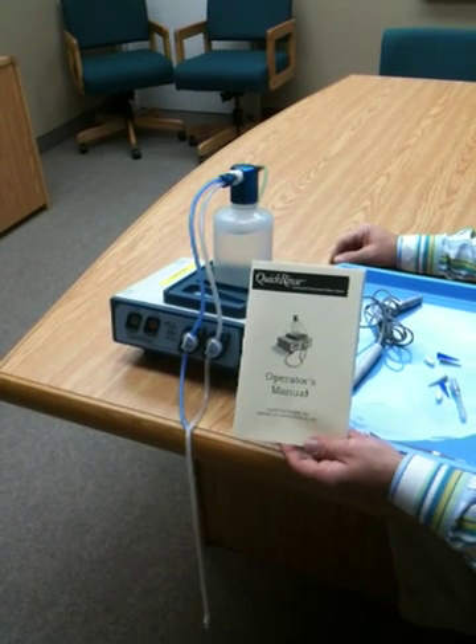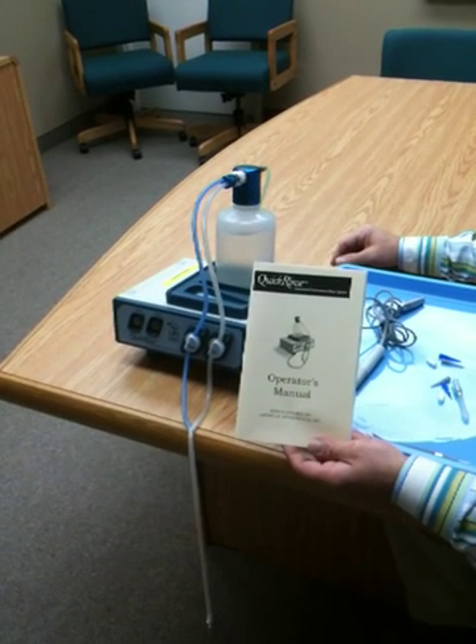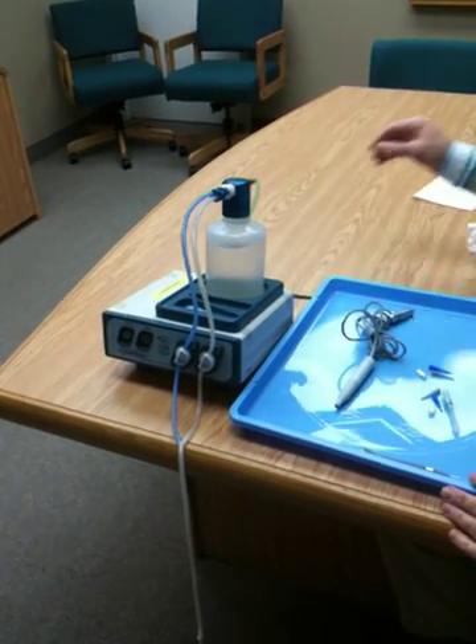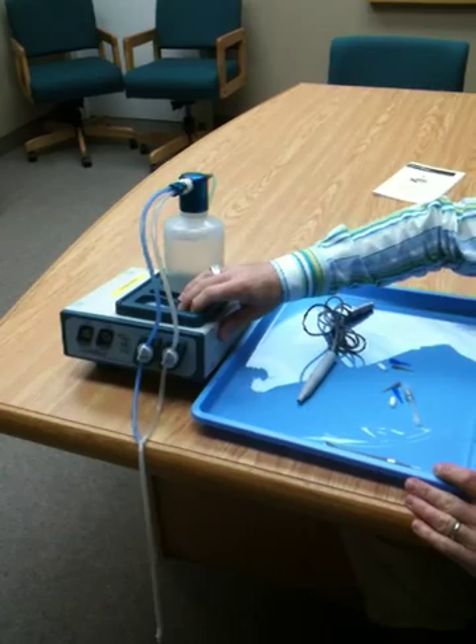This is a demonstration of the Quick Rinse Automated Rinse System, manufactured by American Opti-Surgical. You've seen the setup video and you've set up your Quick Rinse for use.